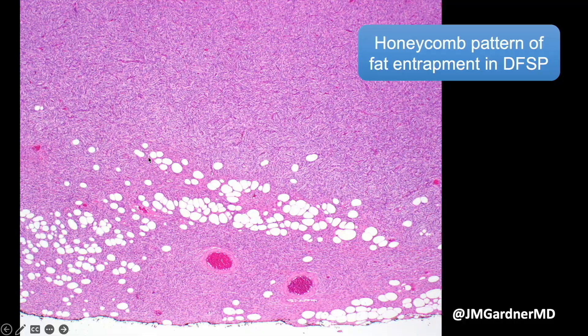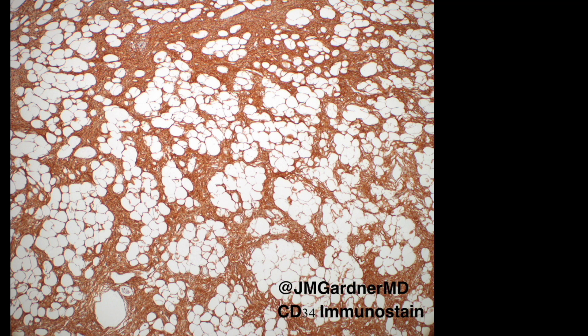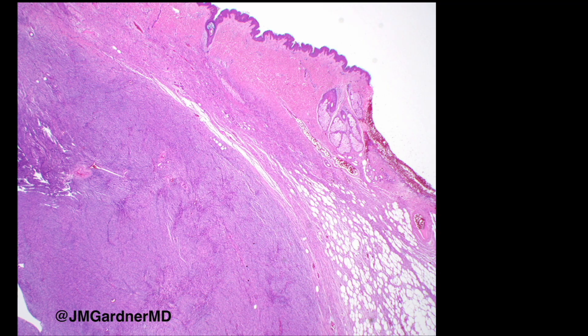Here is more classic honeycombing in an area where the subcutis has not been filled up yet with tumor. And this is the CD34 you want to see in DFSP — strong, diffuse, blazing-positive expression in the tumor.